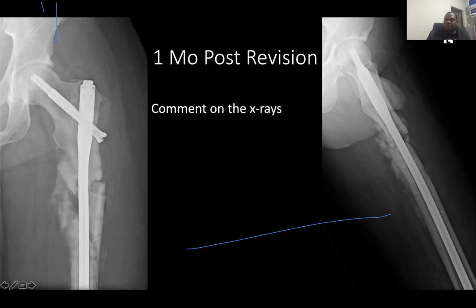Hello? Do you have a comment? I think bone grafting is a very good idea. And I've come across some papers and some people who routinely bone graft if there's severe comminution.